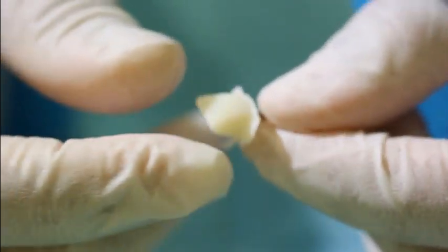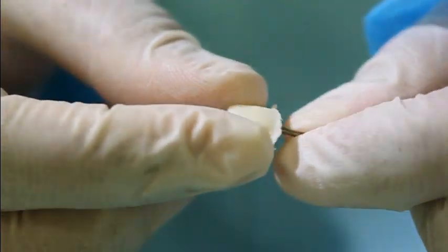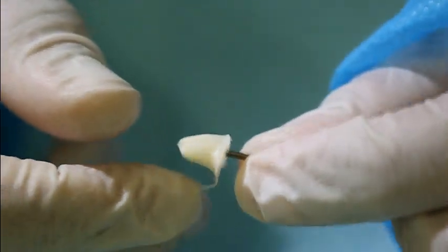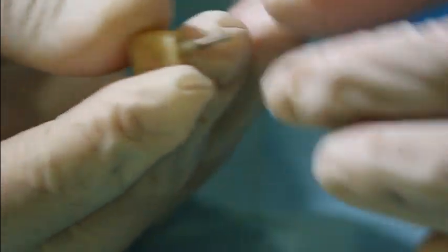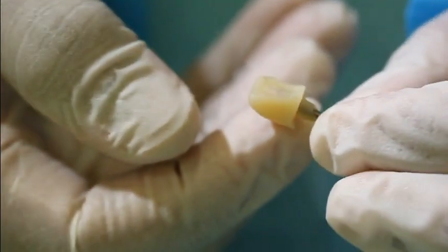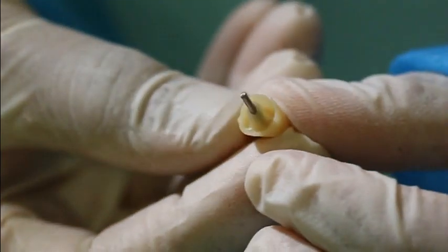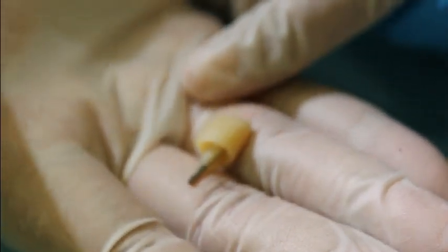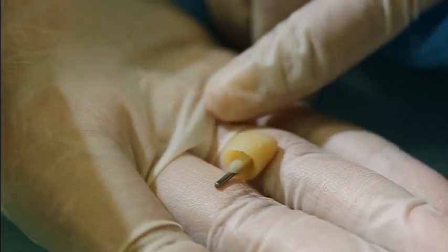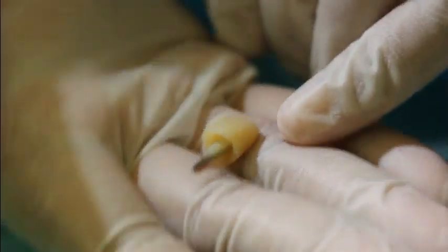The next stage is to remove all the excess. You can use an acrylic bur and a soft flat disc. This is one example of the finished temporary crown and post. You have to use temporary cement to cement it inside the canal and on the crown prep.